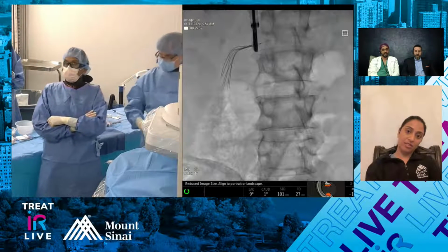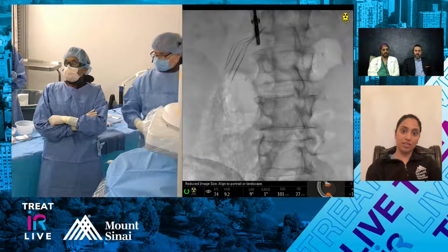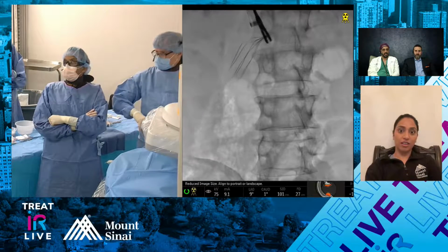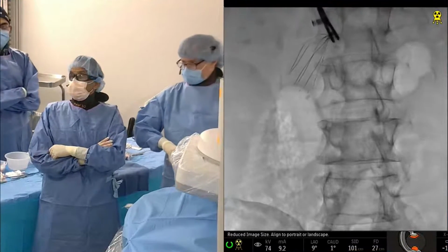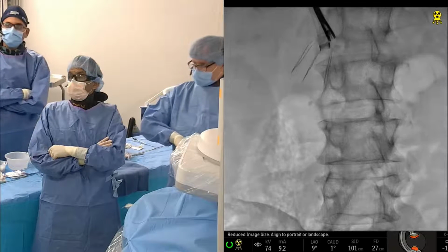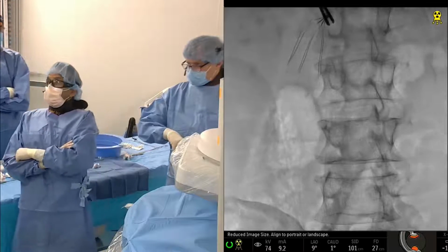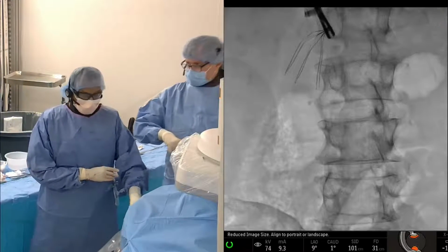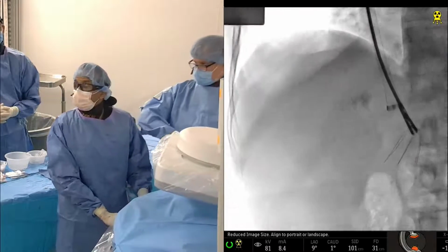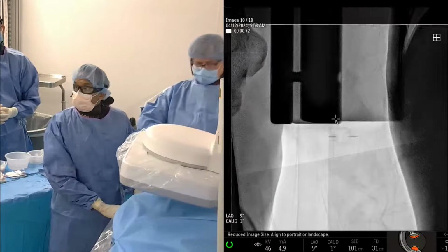If you let go of the forceps... I think the thing is, it's so tilted, it's not going to straighten, right? Yeah, and I think your sheath's so buggered. I don't think it's going to work. I think you're going to have to do it from the groin. See a little higher up, please. I wouldn't drag it too high, because you're never going to be able to get it from the groin, right?